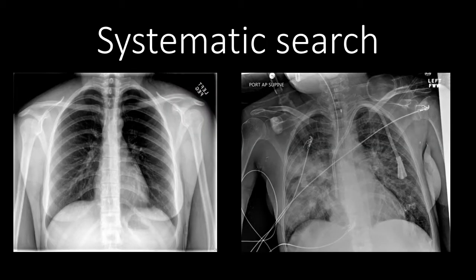A systematic search is important to employ for every radiograph you read. By being systematic and looking at each element of the radiograph, you're much less likely to miss an important finding. This is key when you are looking at what appears to be a normal radiograph, like we see on the left, or in an obviously abnormal radiograph, like we have on the right. In both cases, looking at each element of the chest in the same order for every patient has been shown to reduce the likelihood that you miss an important finding.